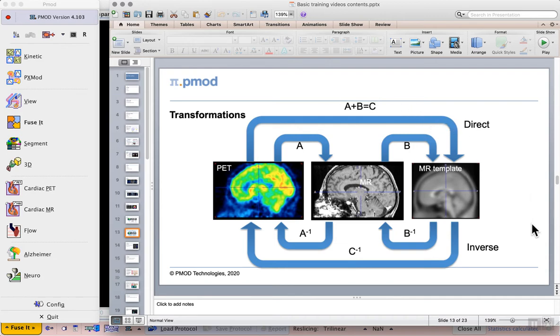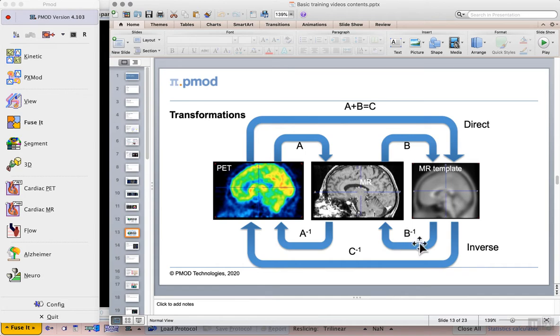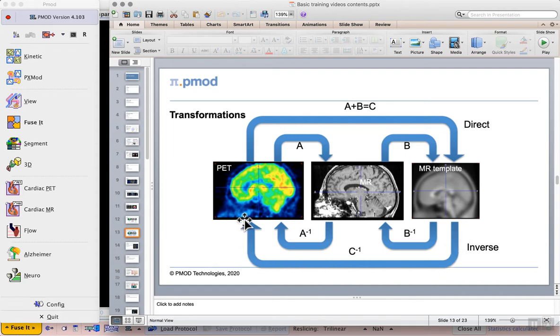We won't look at it in this exercise but for work in our Neuro tool another important concept is the inverse transformation where we have the inverse of those transformation matrices allowing us to go back between any components of our image to transform the atlas to our original PET data for example.